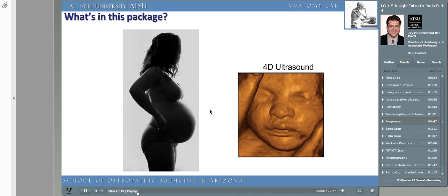Today, ultrasonography generates a 3D image, and for marketing reasons, to sell these ultrasound units to physicians, it's termed 4D ultrasound. The 3 dimensions of the X, Y, and Z axes, with time being the 4th dimension. We believe transabdominal and pelvic ultrasonography to be safe during pregnancy, but some clinicians have attempted to link it to autism. The data is statistically insignificant and does not support this claim. However, always keep in mind any imaging technique has risk.